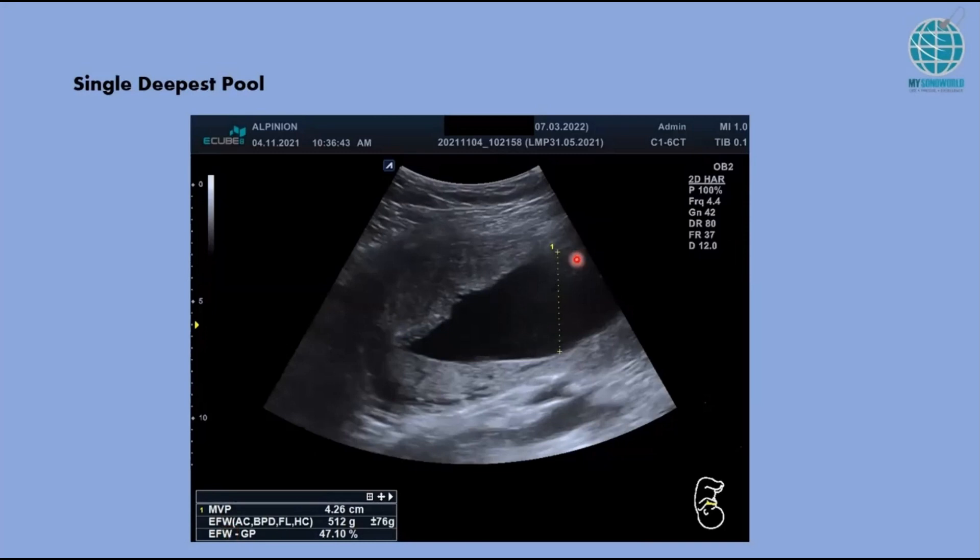Put it at the deepest portion available — don't measure at a shallow area. The probe has to be straight, parallel to the maternal spine. This measurement here is 4.26 cm, which is normal. The normal range is 2 to 8 cm.